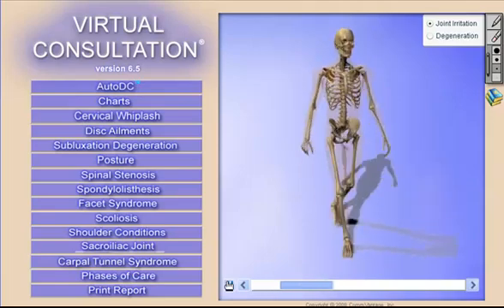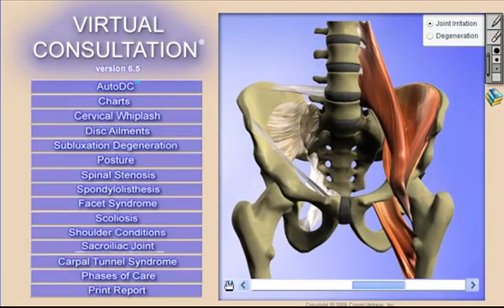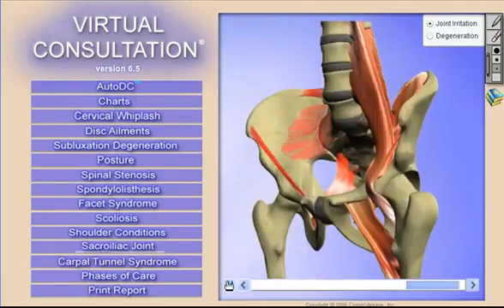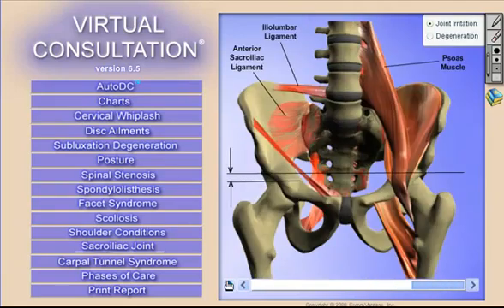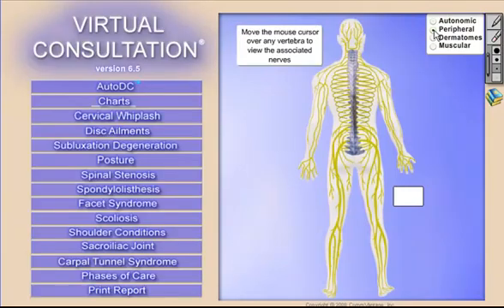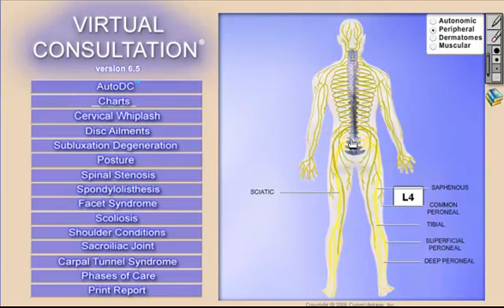Next, let's use the virtual consultation software product to explain the imbalance and the irritation to the SI joint. And with this we can actually take it a step further and tie the symptoms to the condition using our peripheral nervous system chart.